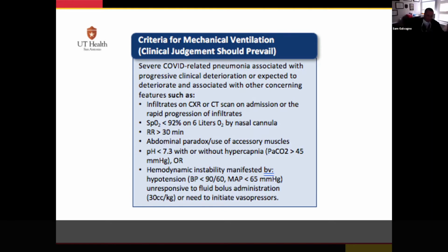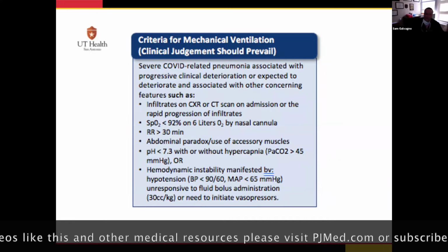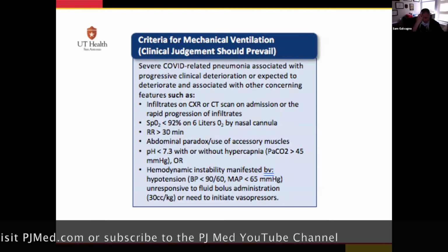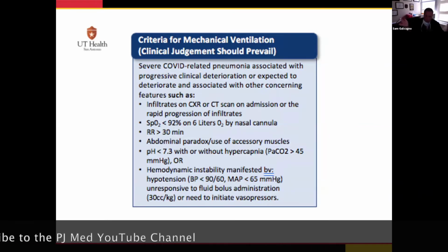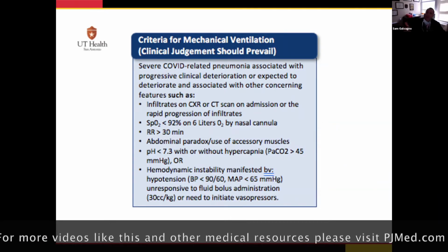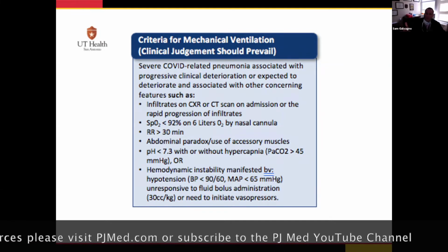Yeah, no, I think that a really, really low sat with a good waveform is probably real, and it's probably dangerous. And we are hearing from my friends at Mount Sinai, a couple of hospitals in Queens, I can't remember which one it was, but it's one of the ones getting hit hard, and my friends at Columbia have all talked about this. These are guys on the front lines who are intubating these patients, and they see that the sat is really low with a good waveform. My caveat would be if it's a good waveform and it's really low, that's something to be concerned about.